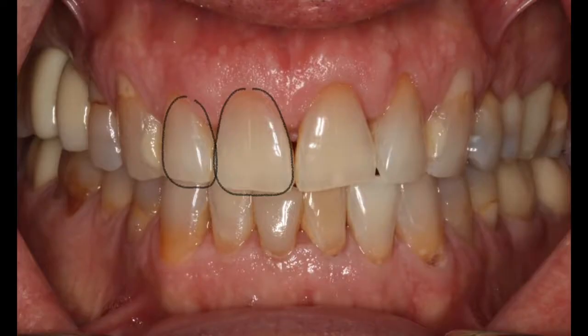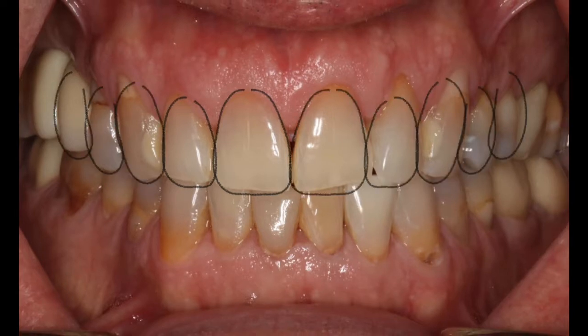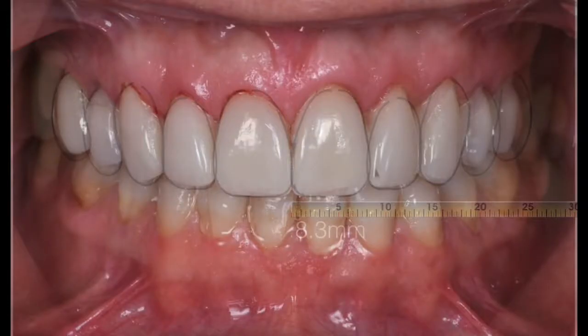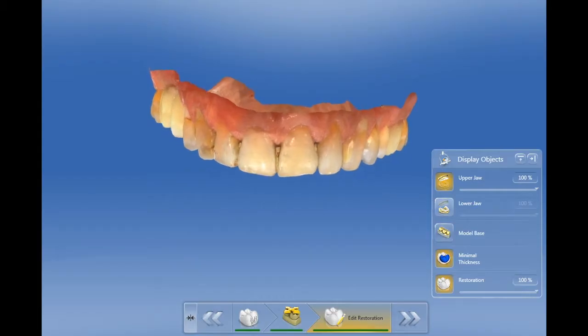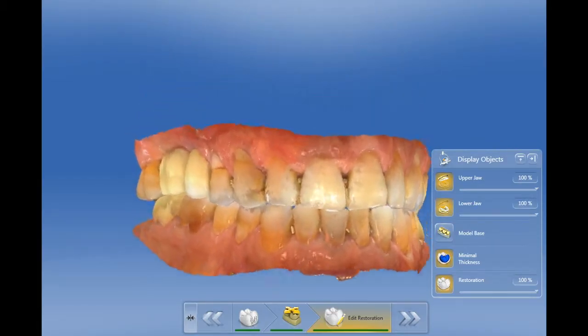His teeth were in relatively good position. We did a smile design mock-up using Keynote. This was done by Dr. Stefan Toothmaster from CDI Science, who also did the final restorations on this case. There was some lengthening of number 9 that we wanted to do, and some gingival architectural corrections to be done with a laser.